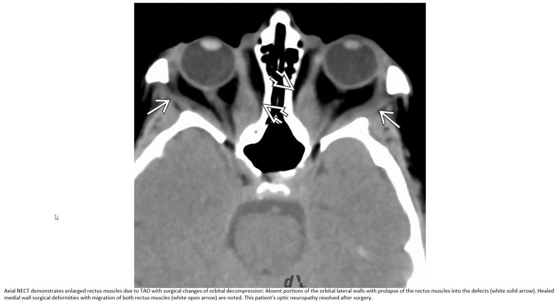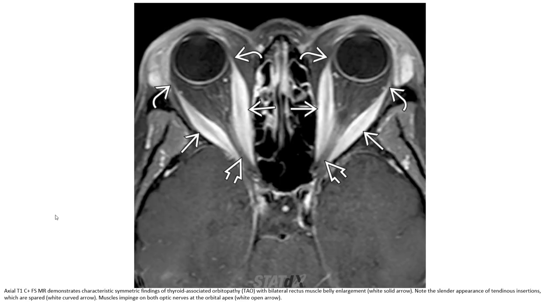Here, post-surgical deformity is noted with migration of both rectus muscles. This patient has optic nerve compromise as a result of the disease. On MRI, there are characteristic symmetric findings of thyroid-associated orbitopathy with bilateral rectus muscle belly enlargement, with the slender pattern of tendon insertion spared, and mass effect on both optic nerves and the orbital apex.